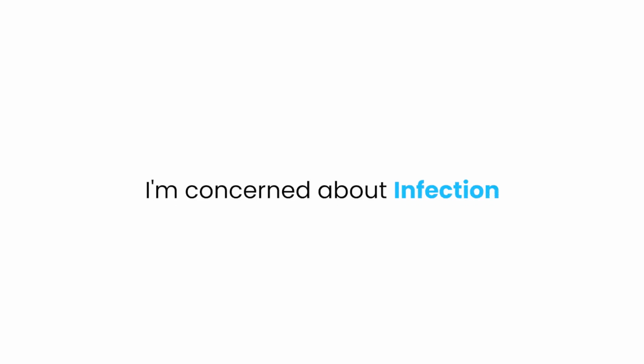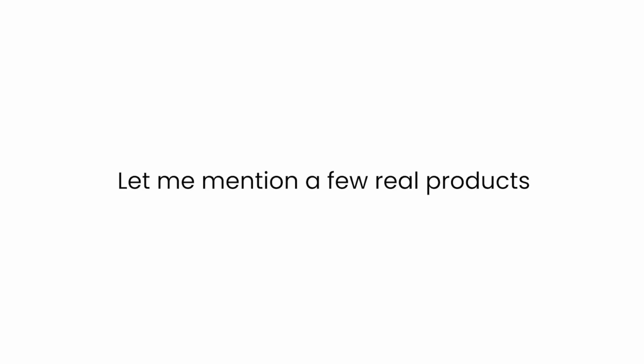Also, when you're discussing a wound with a colleague or consulting with a specialist, you're not just saying it looks worse. You're saying the wound has increased in size by 15% over the past week, slough has increased from 10% to 30%, and surrounding redness has expanded by 2 centimeters. I'm concerned about infection. Let me mention a few real products that are out there right now.